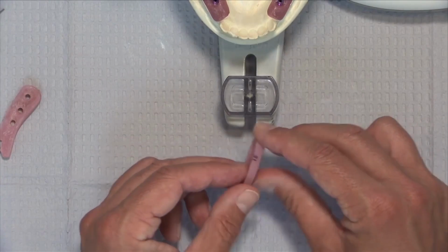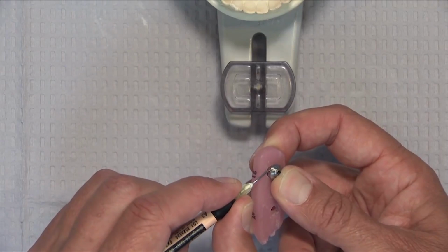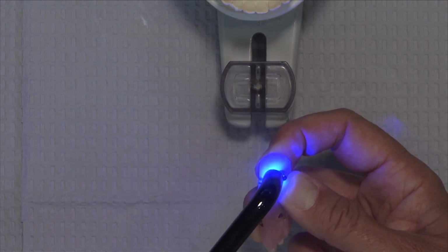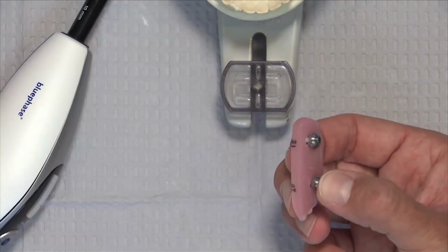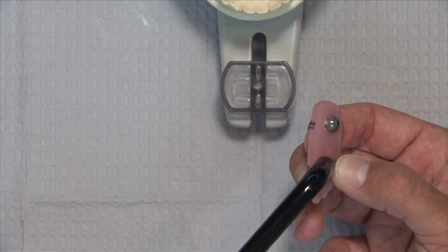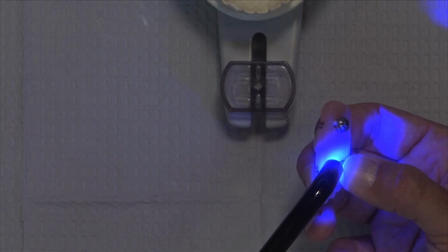So the first thing we're going to do is go ahead and position the custom abutments into the positioning index. Little black dot there on the buccal. I'm going to go right into the positioning index, and then I'm just going to hold that in place with a little flowable composite, just because it's a lower and we don't want it to fall out. And just cure that for a few seconds, obviously without any bonding agent or anything. And then we'll take the custom abutment for number 20 and seat it in place. And again, just use a little dab of flowable composite. And we're going to use this to make sure that we've got the orientation correct of the custom abutments in the mouth. So a nice little seating index here.